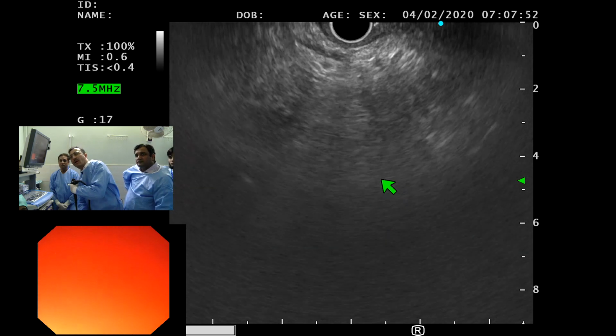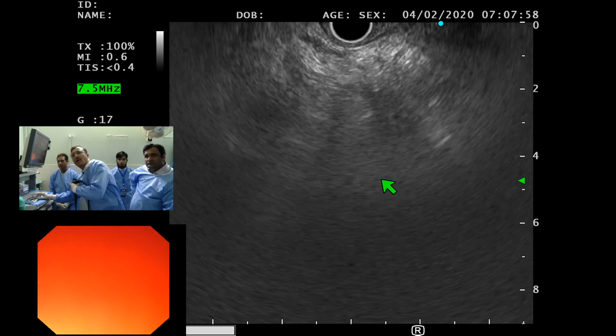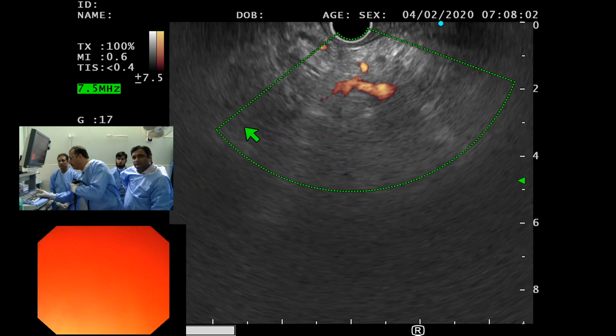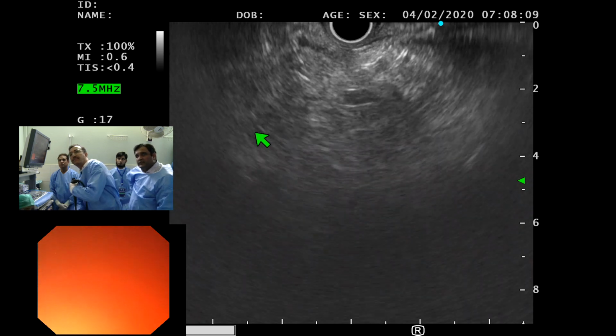Is the stent above the, I mean, what is the shadow that is above, just close to your cursor? That's a vessel. Now we can see it. Yes, that's better.